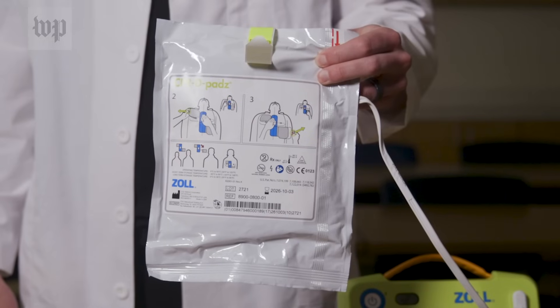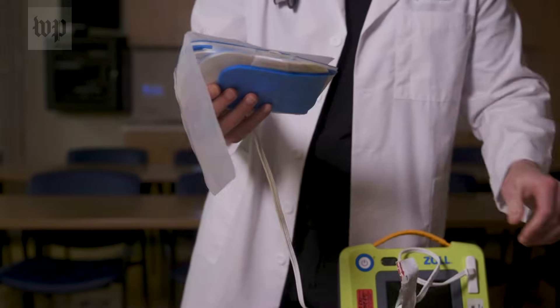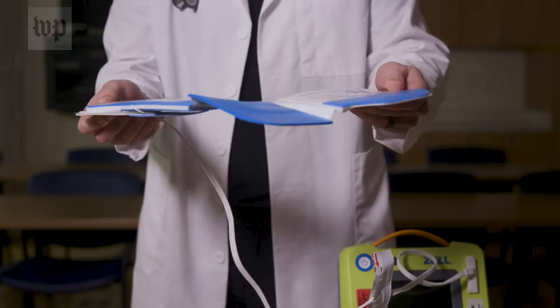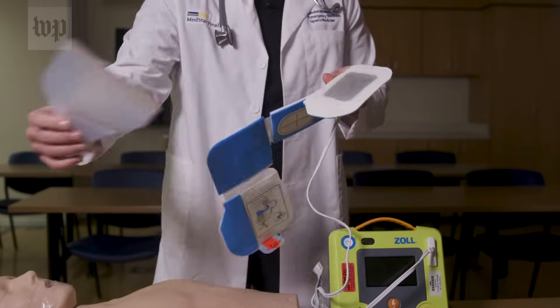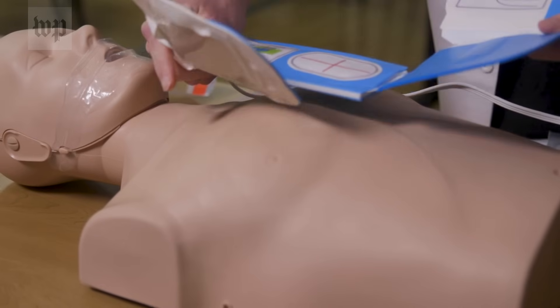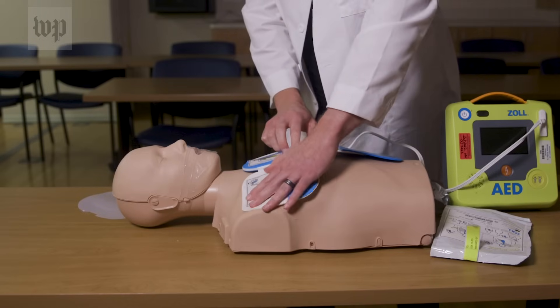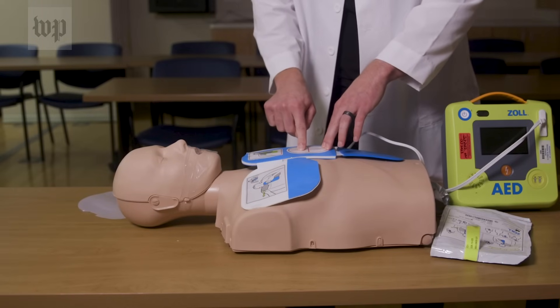It will tell you where to place the pads. Take the pads out of the packaging — you'll see displayed where to place each pad. Undo the back of the pad and attach pads to the patient's bare chest. I'm placing this pad on the right upper side of the chest with the center piece over the breast bone.